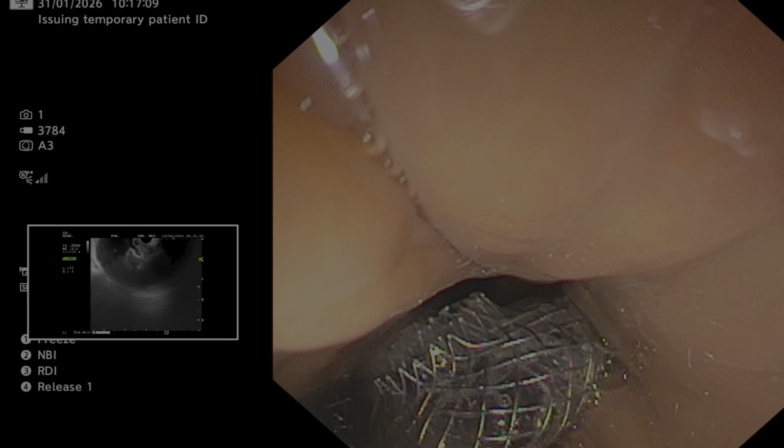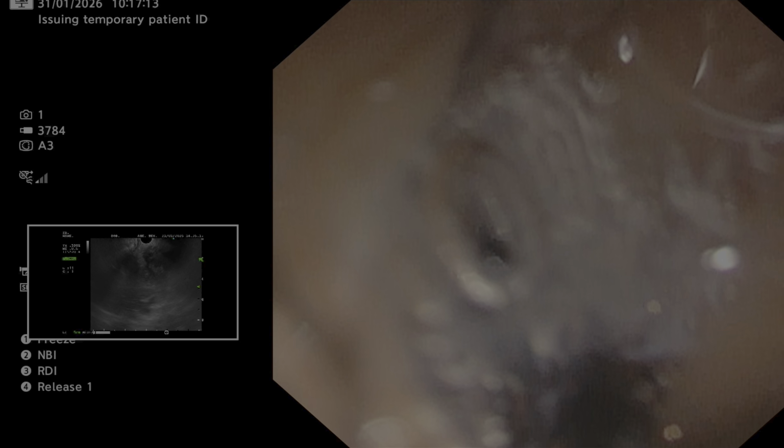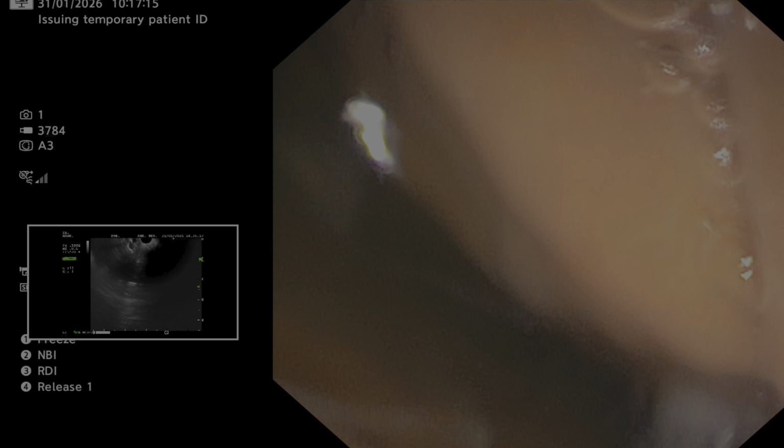Yeah, I mean, it's always nice to look into the EUS image of the proximal flange. You can switch to... Can you show one? Yeah, so we'll switch to EUS again.